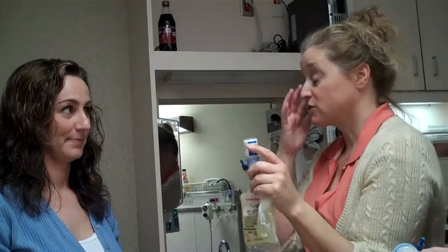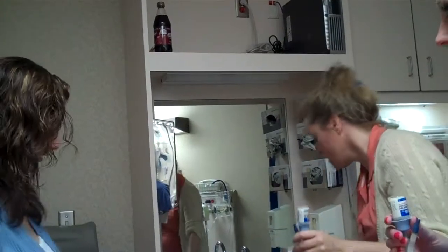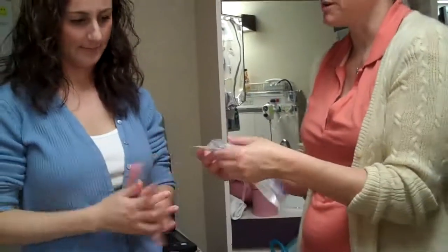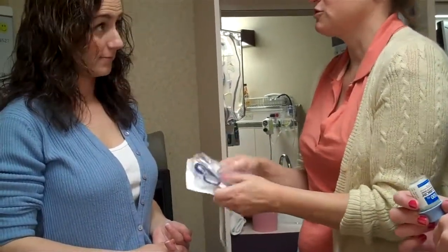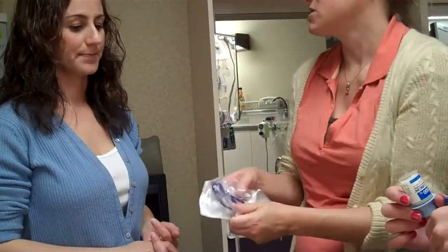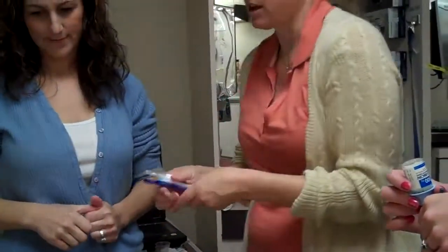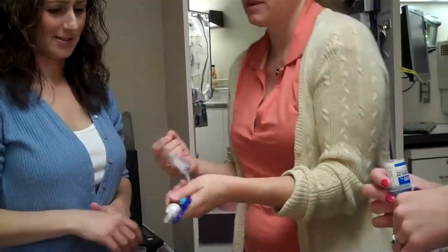So, now we have to hook this up to tubing, because we have to infuse him. This is not the part that makes me nervous. It's the part where I stick it on him. So here's your tubing. You're fine. You're going to open it on the side. Every tubing is good for 2 infusions. So 1 tubing per day. Every day you get a new one, and you'll create lots of medical waste here, because you're going to trash lots.